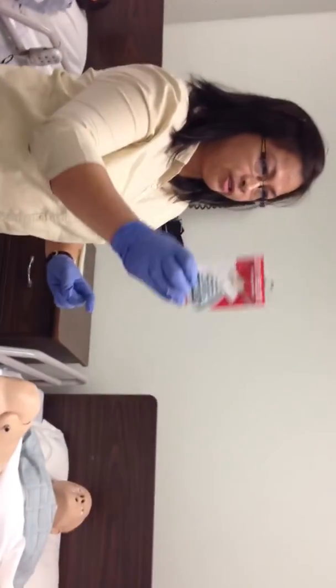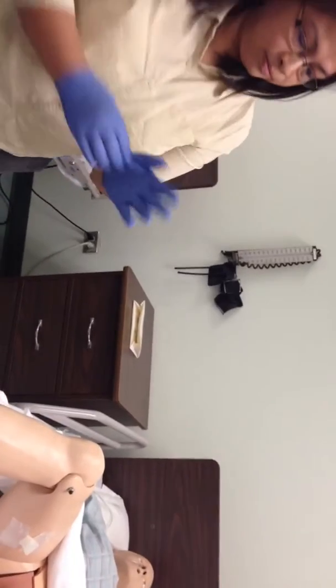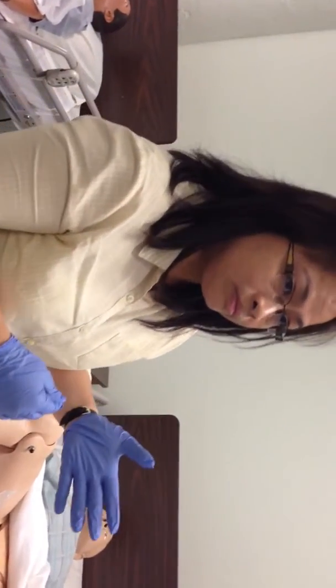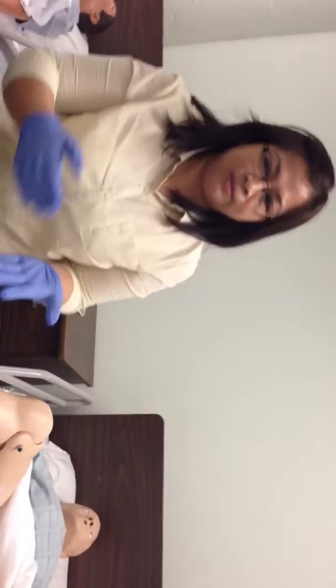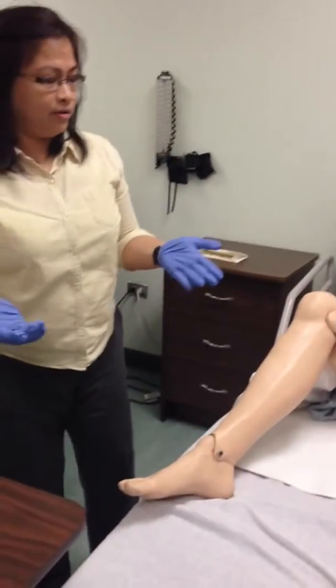Okay, make sure you take this. All right. Then you're gonna remove your gloves. So we gather ourselves the supplies. It's not going to be ready for us. We're just going to pick it up. Of course, you have to pick it up. Okay, all the supplies. If it's already there, we don't have to open it, right? You don't have to open it, but you just still verbalize it. Yeah, you just gather.